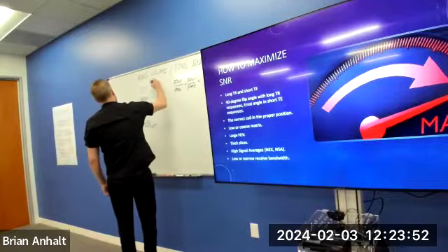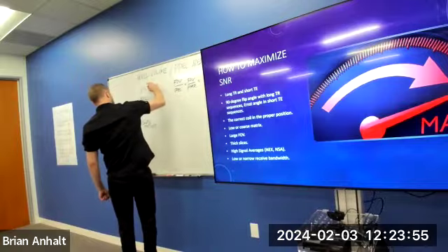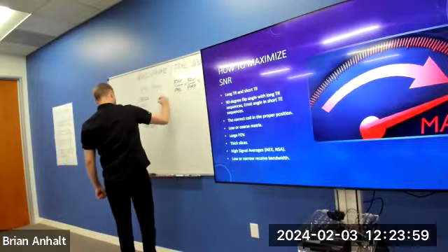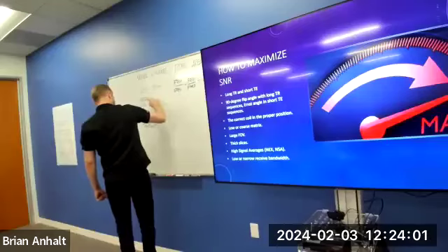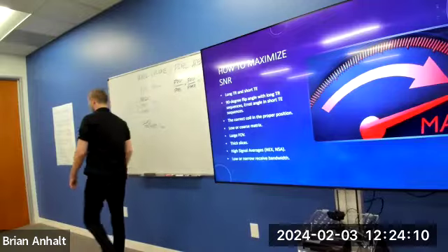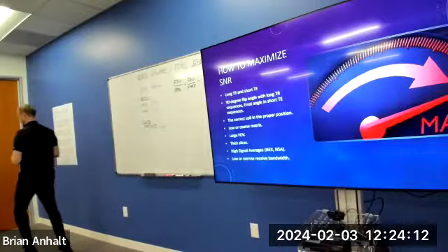Field of view, 180 millimeters. Matrix frequency will be 384. 224. Slice thickness 3. What do I want to do first? Give me pixel area.